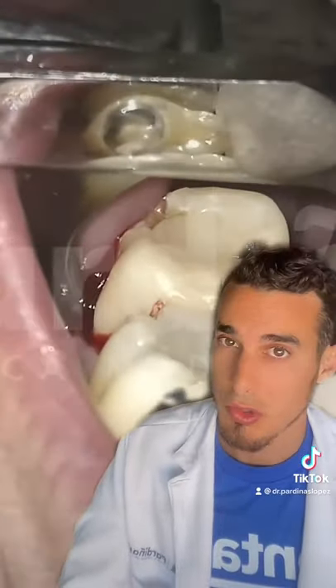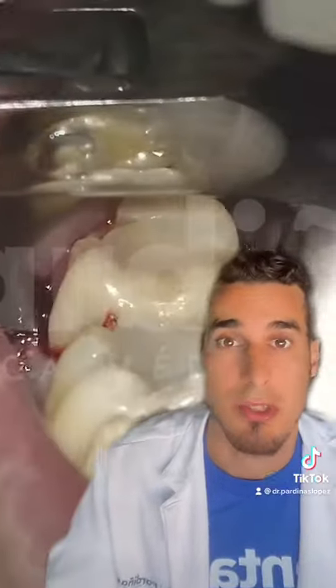After that we're gonna gently luxate the tooth using instruments called luxators. Following that, we're gonna use special forceps designed for each tooth that needs to be extracted. In this case we're gonna use a forceps called cow horn.